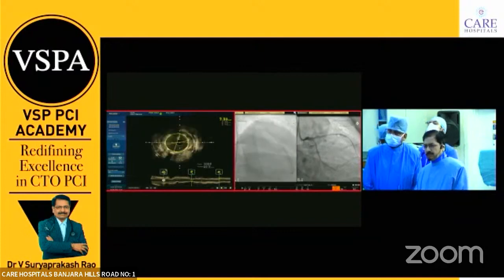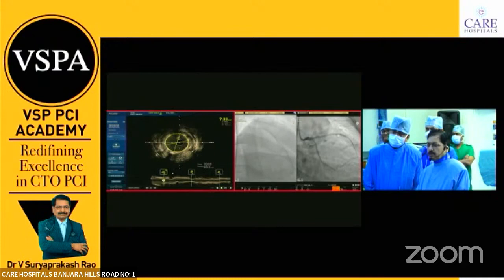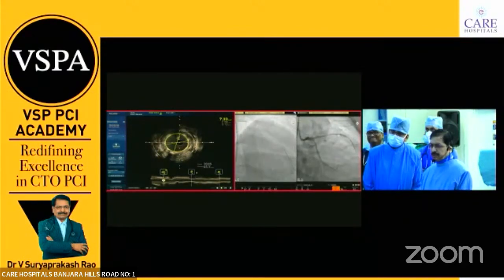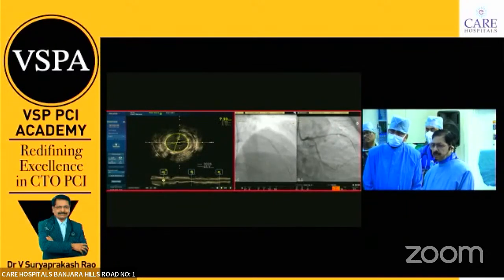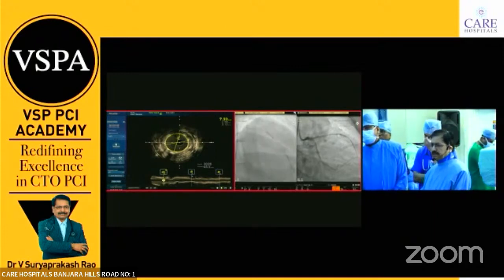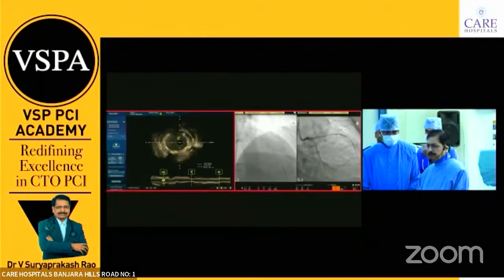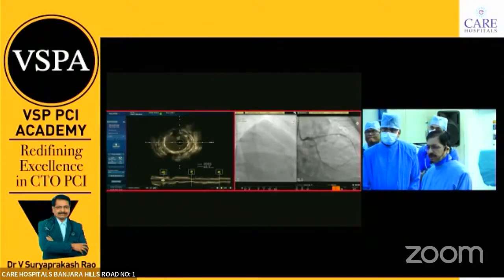Here we used the Acuforce balloon. In this, we tried the Apollo balloon for the 2.5 stent, but we needed to go to very high pressure. We used the Acuforce with 28, 26 atmospheres, high pressure dilatation of the overlap area and the proximal stent. IVUS has shown that the ostium has to be dilated to 3.5, so we again went ahead with the 3.5 NC balloon and stretched.